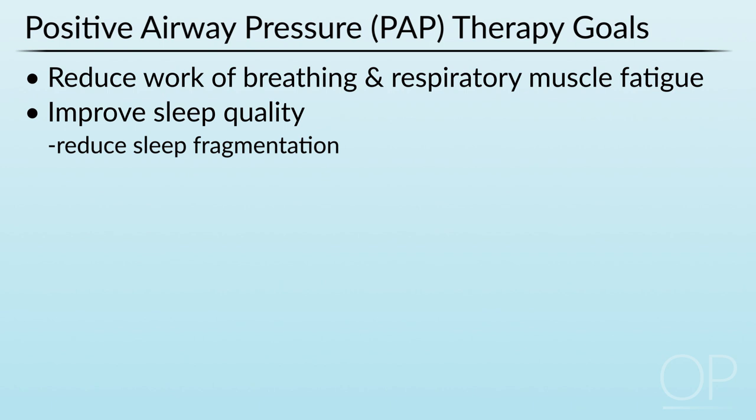And it also improves your cardiac function. If somebody is stressed out because they're having poor sleep, because of poor breathing, that increases your sympathetic drive. You tend to be more stressed out, and positive pressure also reduces your sympathetic drive. Hence, patients who are treated with positive pressure therapy for obstructive sleep apnea tend to have a better sympathetic tone. Hence, their blood pressure and other things tend to be in a much more normal range.